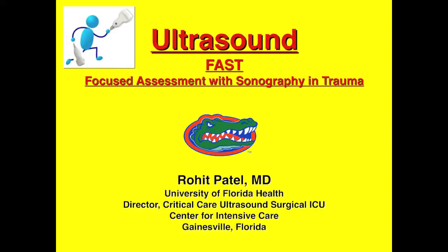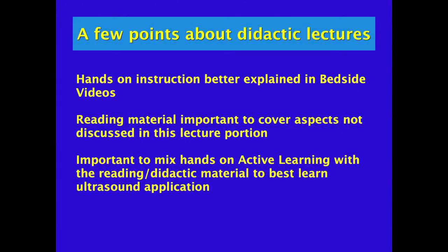This didactic lecture is on FAST, Focused Assessment with Sonography in Trauma. A few points about the didactic lectures. Remember, hands-on instruction is better explained in the bedside videos. The reading material is important to cover aspects that are not discussed in this lecture portion, but that are important for your knowledge base. It's important to mix hands-on active learning with the reading and didactic material to best learn the ultrasound application.